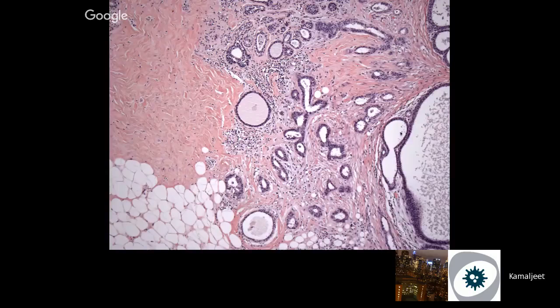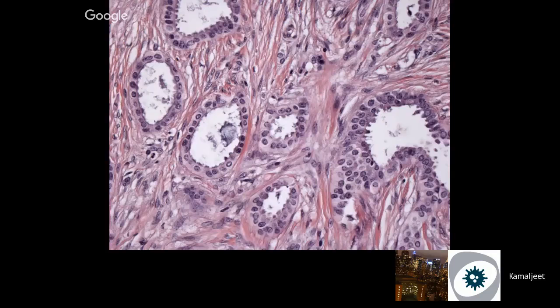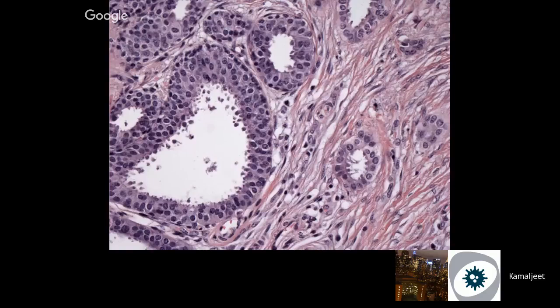More pictures comparing the stroma between the tubular carcinoma and the benign breast tissue. They have the snouts, the cells in the tubular carcinoma. They are ER positive and HER2 negative, something related to the CAP guidelines that you want to know. More high-power pictures of tubular carcinoma, flat epithelial atypia. I'm not going to show more pictures of this, so they are associated with FEA.